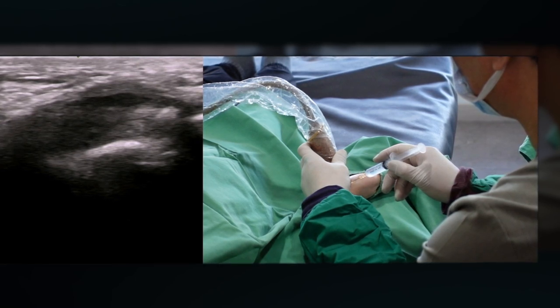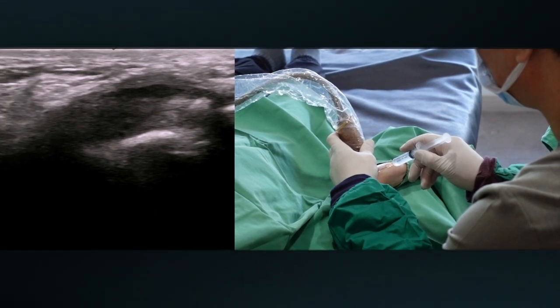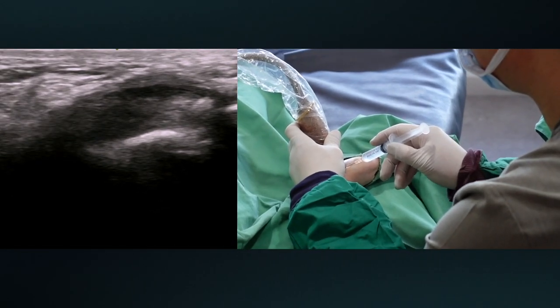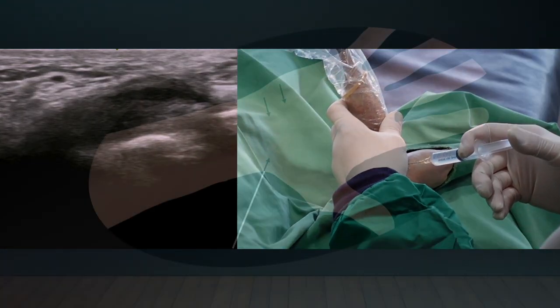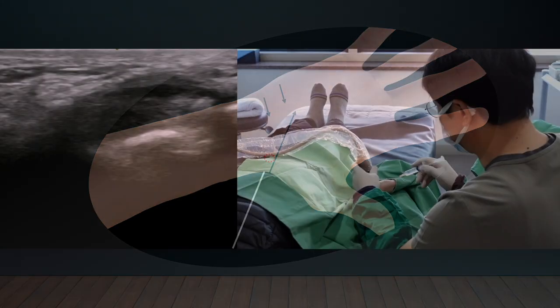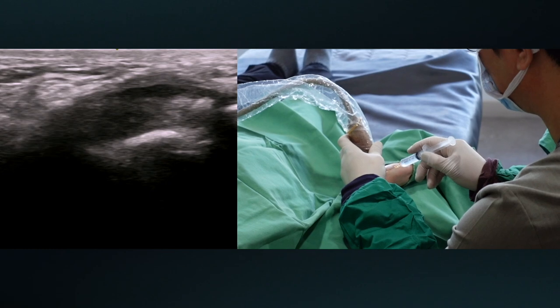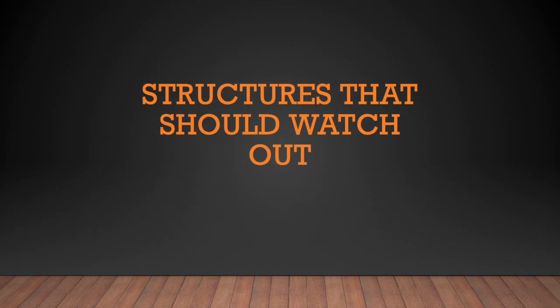I keep an eye on the superficial volar artery, the ulnar artery, and the palmar cutaneous branch of the median nerve. Please watch the direction of the median nerve from the schematic drawing. Small arrows indicate the pisiform and hook of hamate, and the red circle indicates the needle entry point. The needle moves obliquely toward the pisiform and hamate. The ulnar artery is on the far side and the superficial volar artery is on the near side.